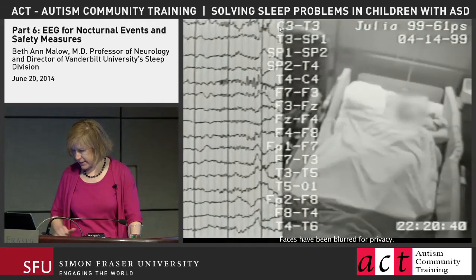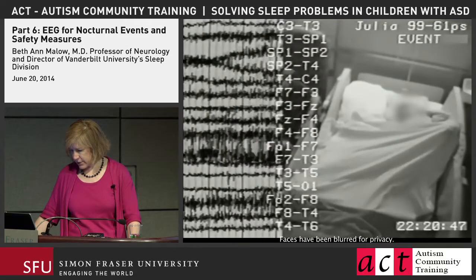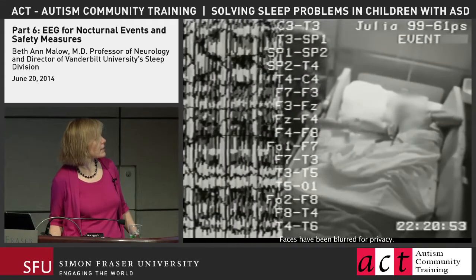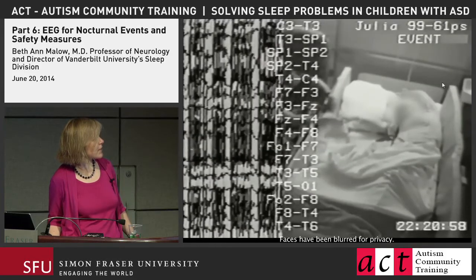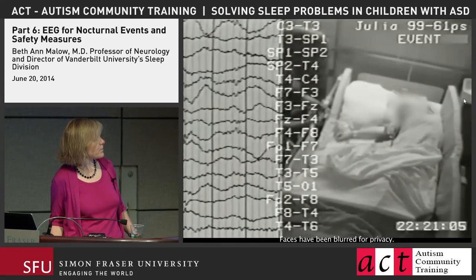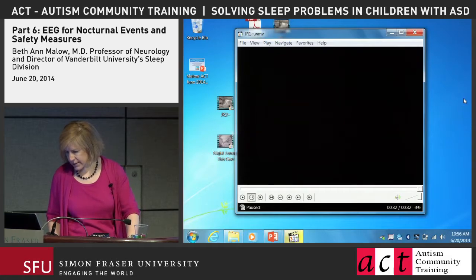This is the first example. This is a young woman with frontal lobe epilepsy, and watch her left arm, which is under the bed sheets, extend. You can see that right here. And now it's lifting up, it's out of the bed sheet, and it's coming over her head. Her right arm is extended out. We call this a fencing position. And what's happening is the video is showing you the event, and the EEG is showing you the seizure activity.